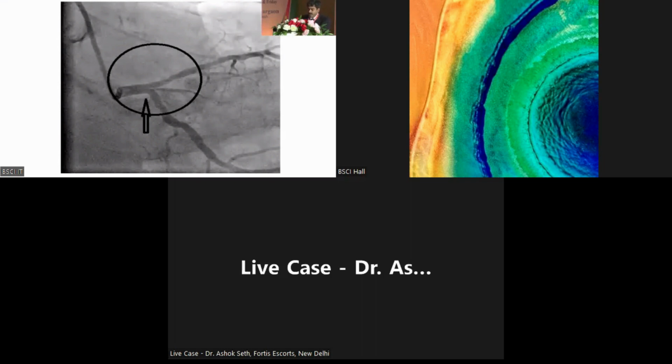So you cannot place the stent there, though the left main ostium and distal left main are not very significantly diseased. But in such a spiky carina, particularly in angiogram or in the IVUS, you cannot put the stent in the LAD ostium. They will be severe, they will be pinching and will be in trouble. So you have to put the stent from the left main to LAD and see what we can do for the circumflex.